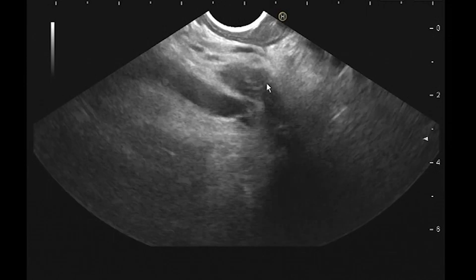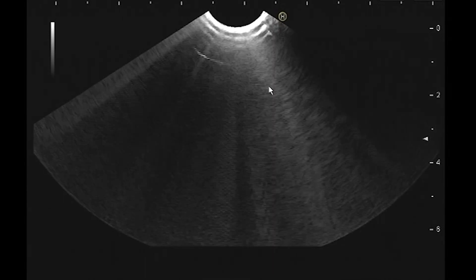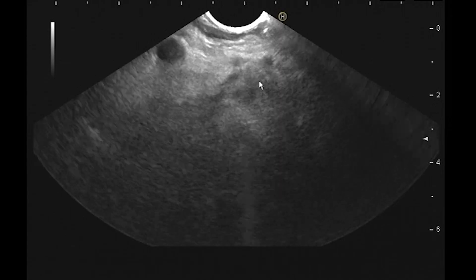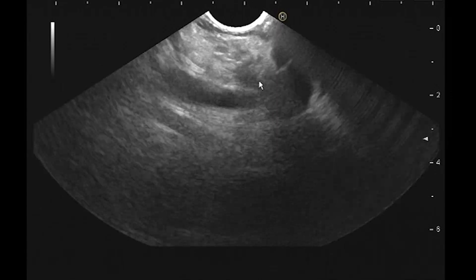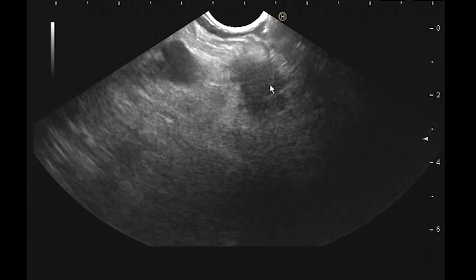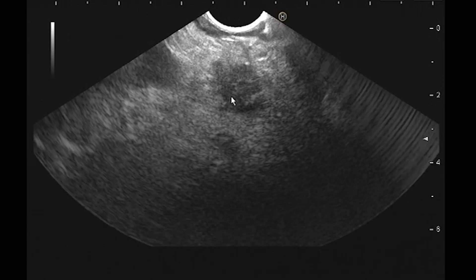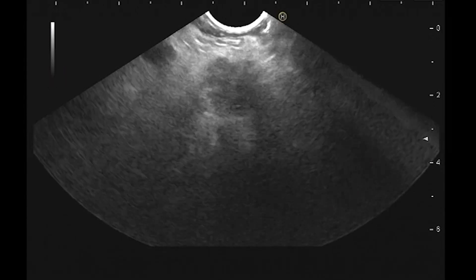When you biopsy, you want to biopsy right where it becomes abnormal. I think I'll get it better from the stomach. I want to go right where the lesion starts, where there's nothing dilated, because by definition if you see a mass, you can't have anything dilated inside the mass. I'm not really concerned about tumor seeding because the confluence is encased — so it's basically inoperable already. Unfortunately, it's not going to really change much for her.